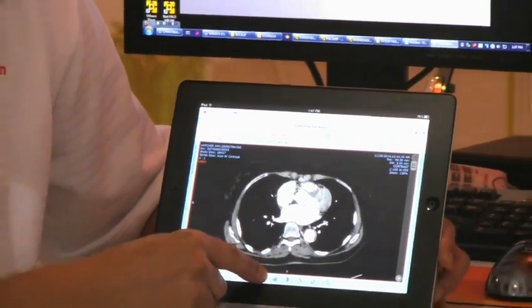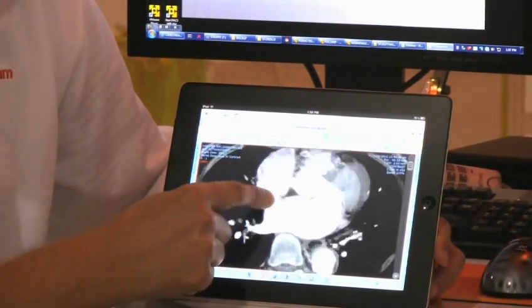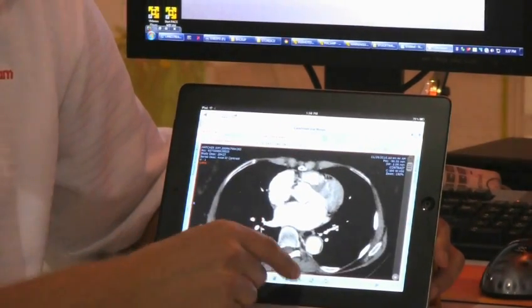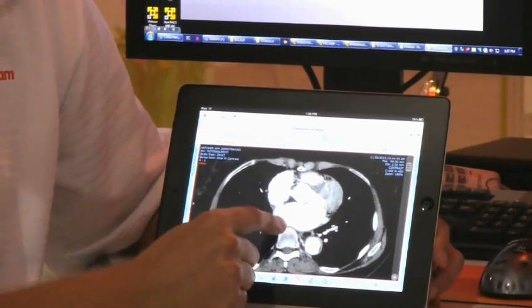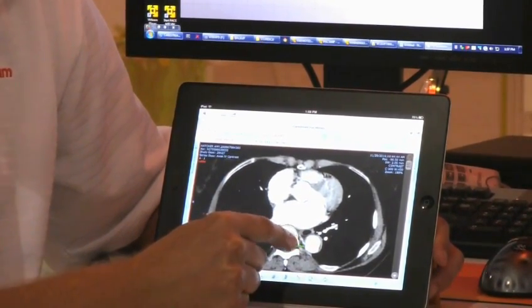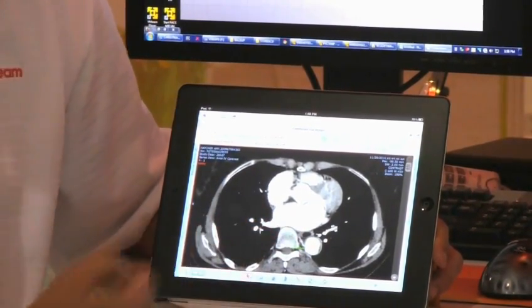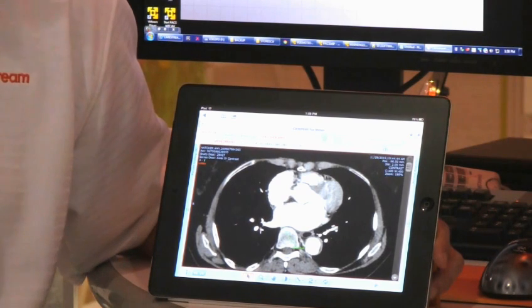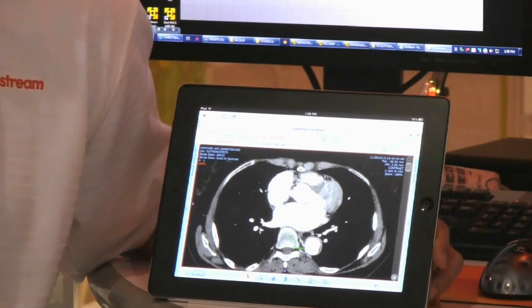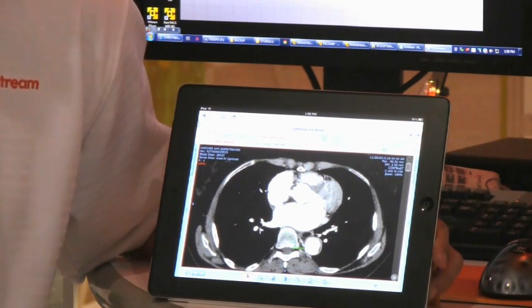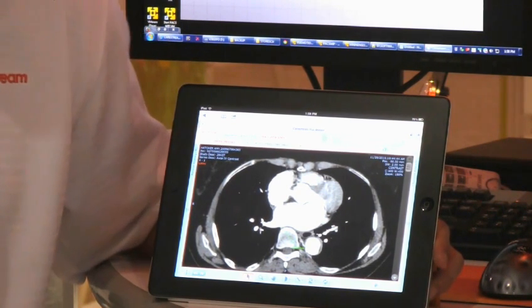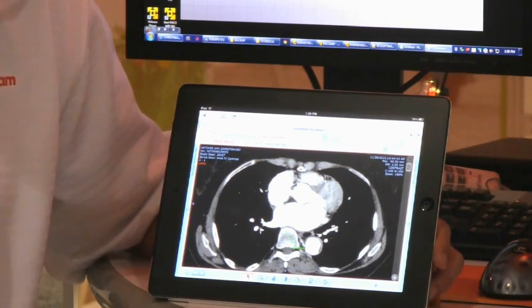They also have access to their basic tool sets such as zoom, pan, window level, basic measurements, and the other functionality that has been included with ViewMotion since the initial release about a year ago.